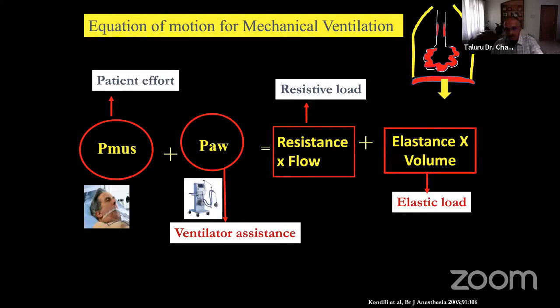So it is better to learn. In present-day practice, a lot of pressure support ventilation, especially with the LMA, is being applied. So this is what is coming into the operating theater also. And in most medical colleges, critical care is managed by anesthesiologists. So it is better to learn all the modes and the intricacies or the physiology involved, so that you can go and clinically deduce what is best for your patient.